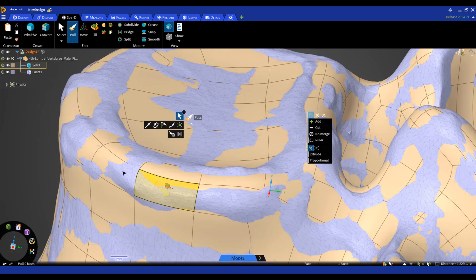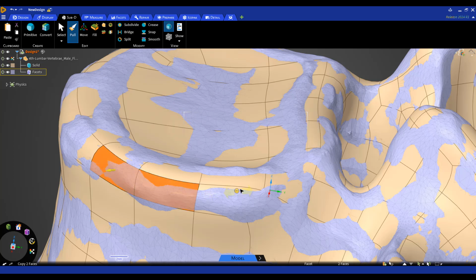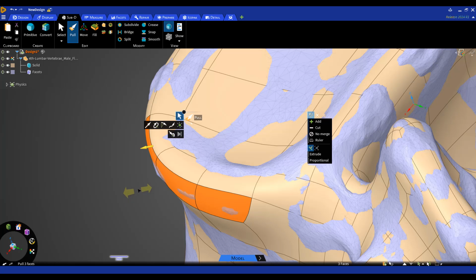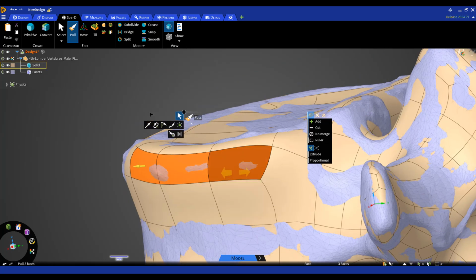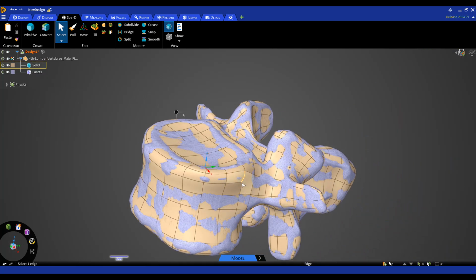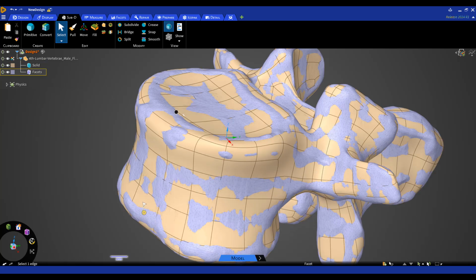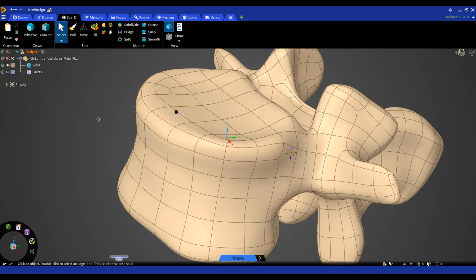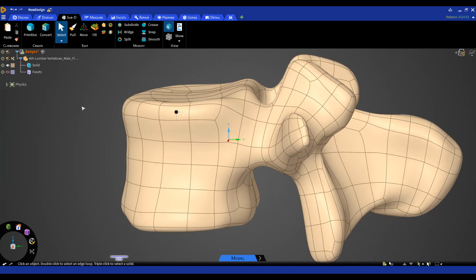I can grab any of these areas. Maybe I want to select a few of these and say, hey, I feel like these areas should bulge out a little bit more. I can just do that. Or I can subdivide the geometry as we see here and get even more refined area, maybe capture some of these protrusions. So now we have a subdivision model here that's obviously much easier to handle.